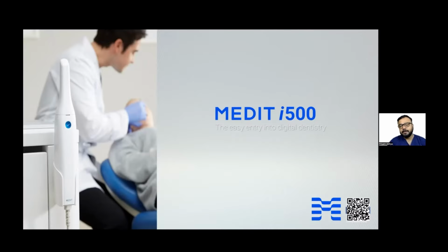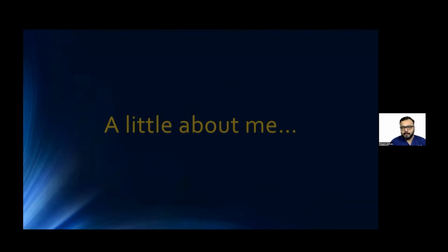When I started with Medit, I was using the i500. The technology improved and we got the new i700, which most of us are using now. And of course, the future is already looking at us. The i900, which is a fabulous piece of equipment, is already there in the market and getting launched zone by zone or country by country.